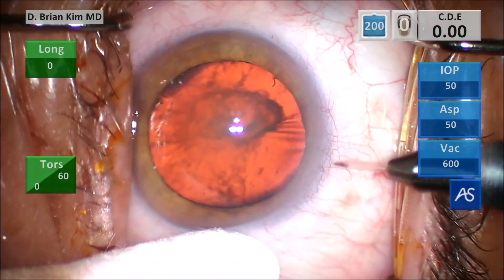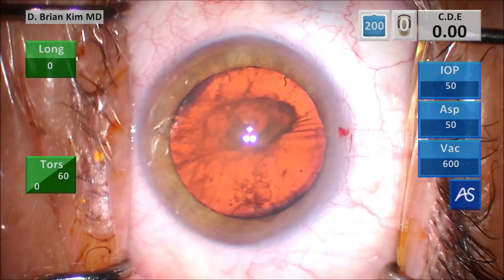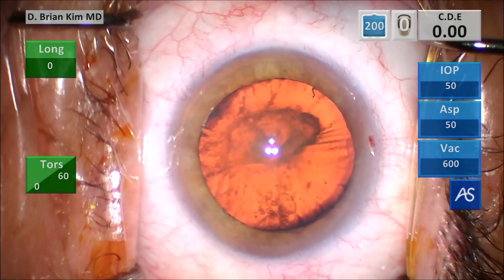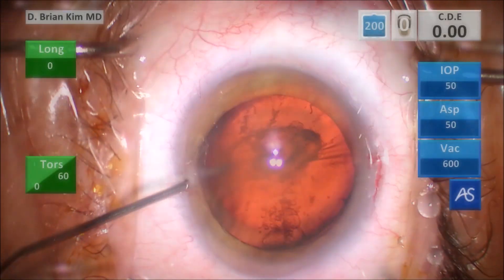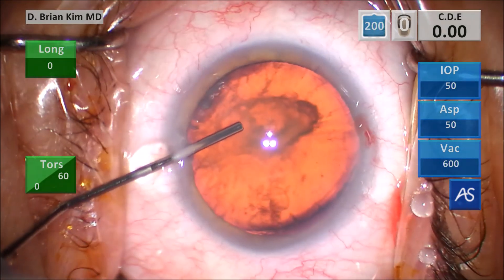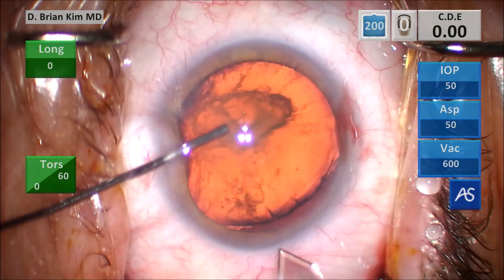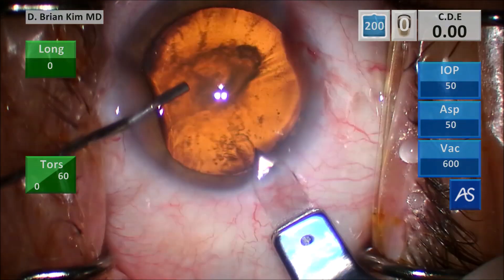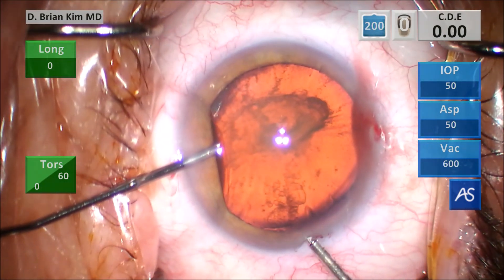I go ahead and make my paracentesis incision first on the right side and then the left side, making sure I'm parallel to the iris plane, which creates a nice corneal shelf allowing me to achieve a self-sealing incision. This is intracameral epinephrine and then some dispersive viscoelastic to coat the corneal endothelium and flatten the anterior capsule. You can see when I push the viscoelastic the lens bowed back significantly, and towards me in the sub-incisional area there is some zonular laxity — I can actually see the edge of the lens.